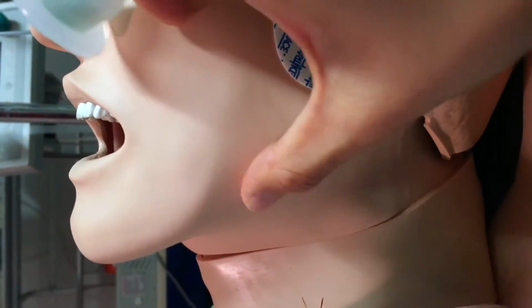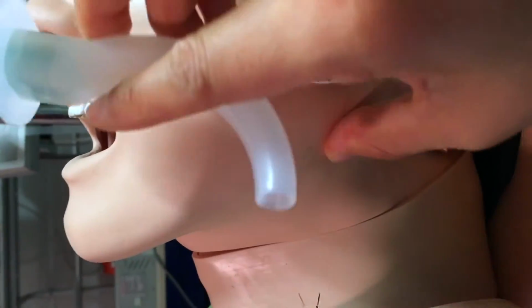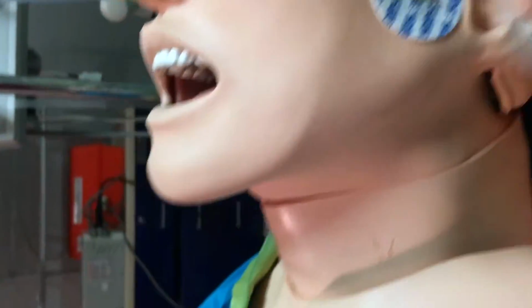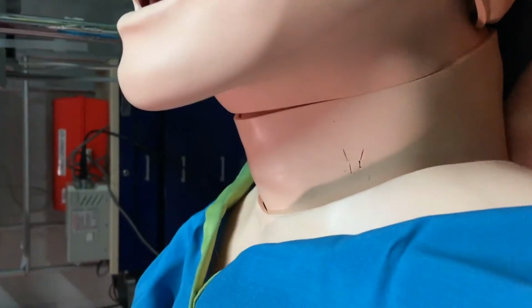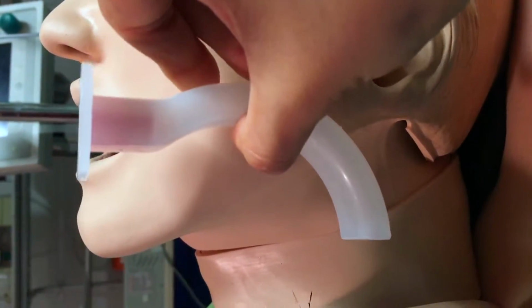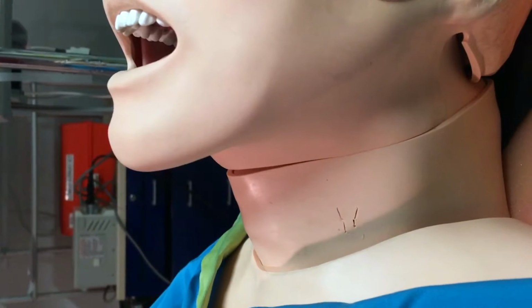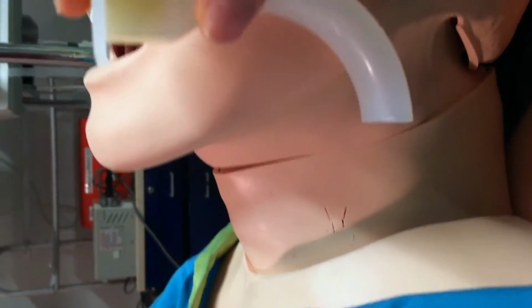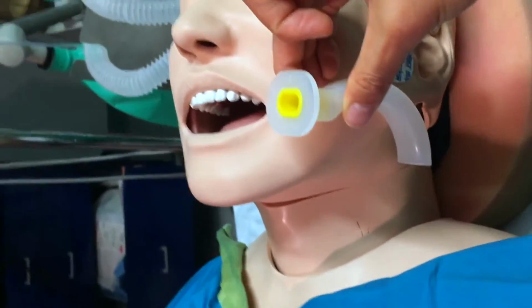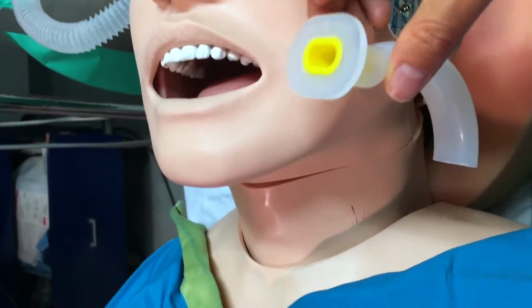So the angle will be around here, and as you can see, this is kind of short. I'll try the red one. Maybe I'll overcompensate for it. It's actually past the angle, so this might be a little bit too big. So I try this one. It seems to work pretty good. So I'm going to go with a 9, which is pretty average.